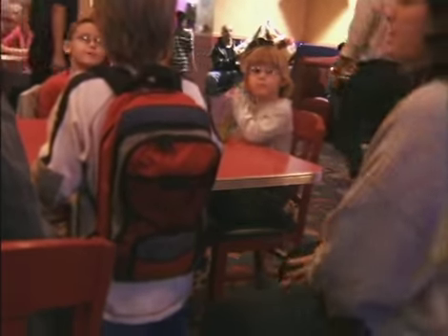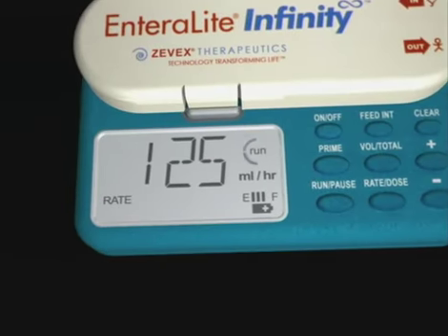The EnteraLite Infinity will run for 24 hours at a rate of 125 milliliters per hour. The battery will run down faster at higher flow rates. Slower flow rates and interval feedings will allow the battery to last longer.